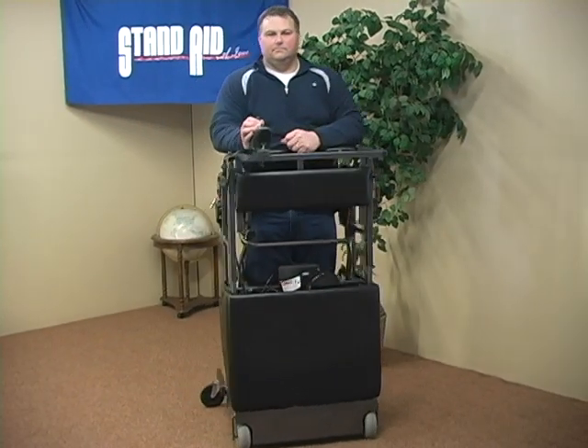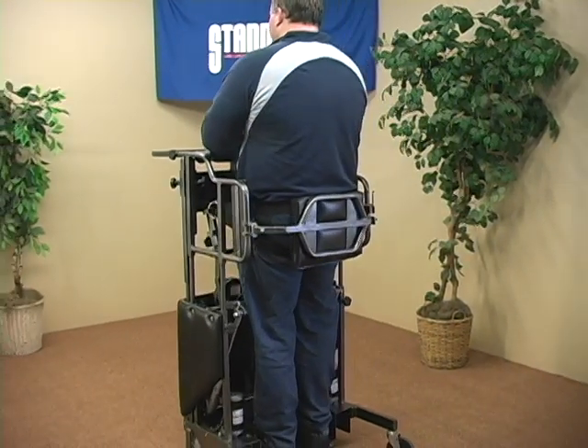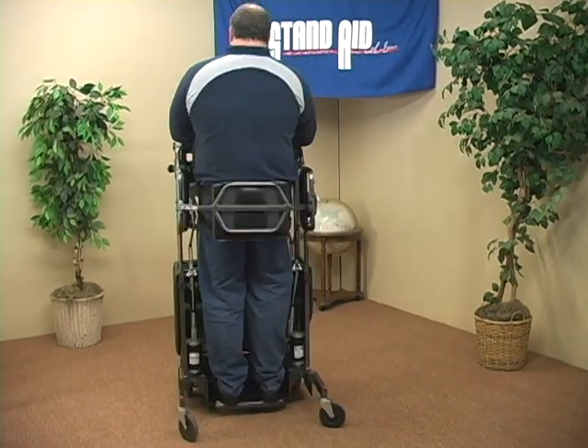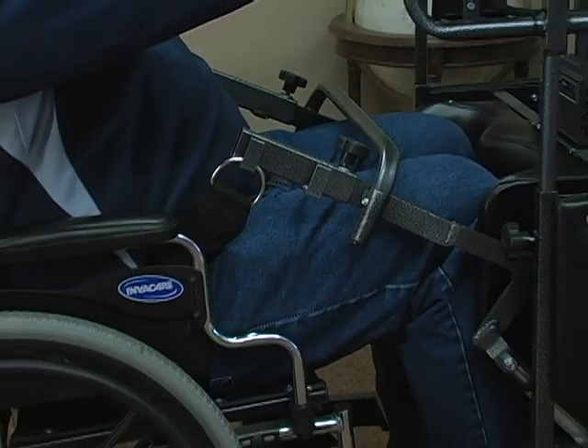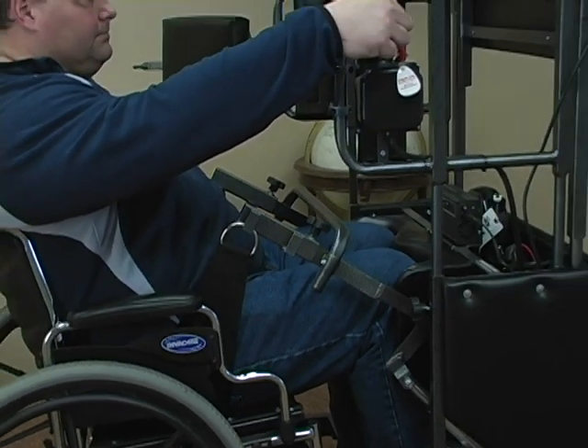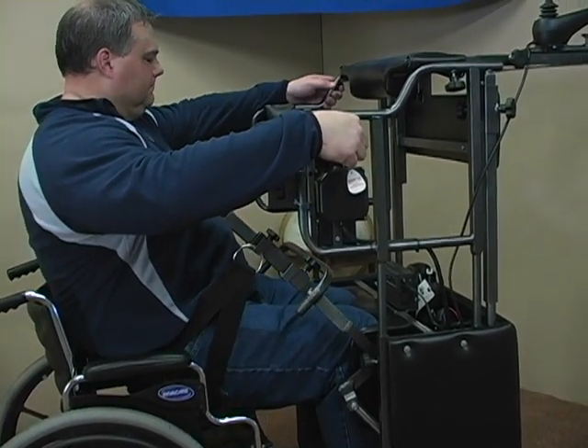With the ability to be mobile while standing, the user will experience greater independence and the desire to stand more often. The Stand-Aid 1503 stands the patient directly from their wheelchair or other seated surface, requiring no transfer and no lifting by the caregiver.